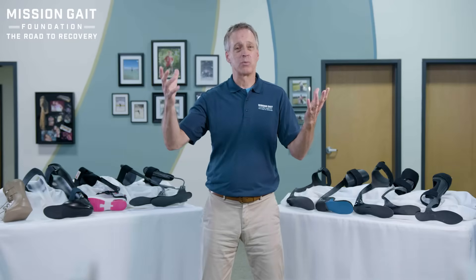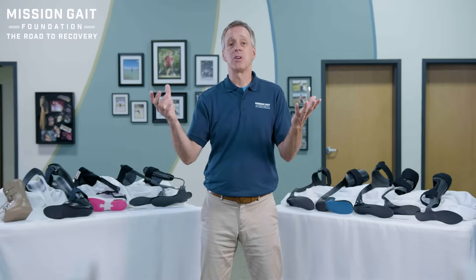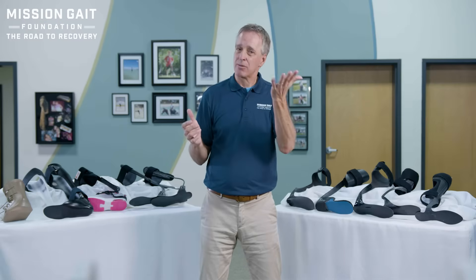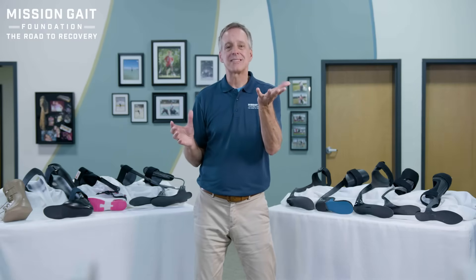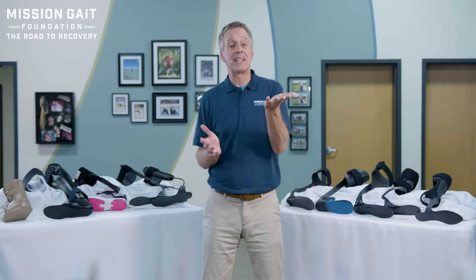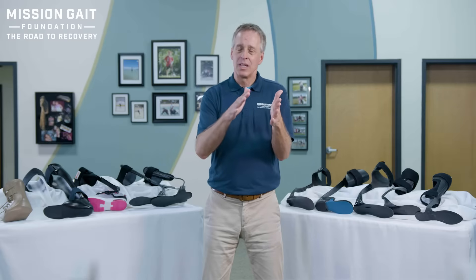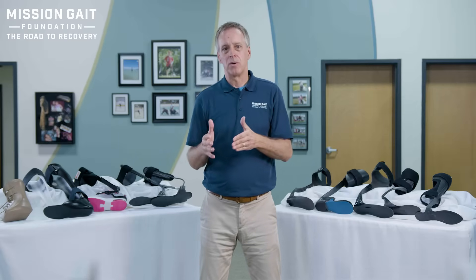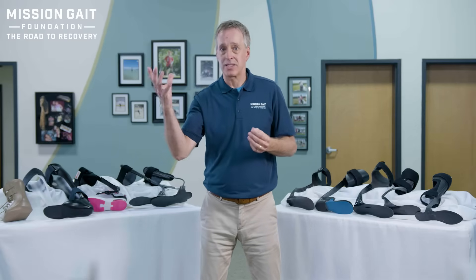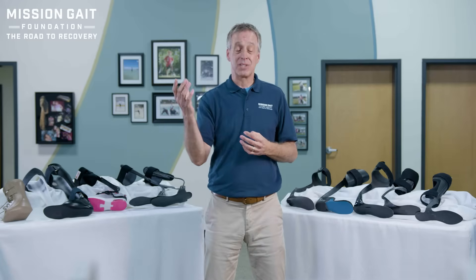The best brace may be custom made, lots of bells and whistles, works beautifully — but the patient may not like it for numerous reasons. The good brace is a great brace for the patient, but far less technical, easier to put on, probably fewer moving parts or things that need maintenance. So I want to say, let's get the best brace for you. But you might say the best brace is always the best brace — not necessarily.